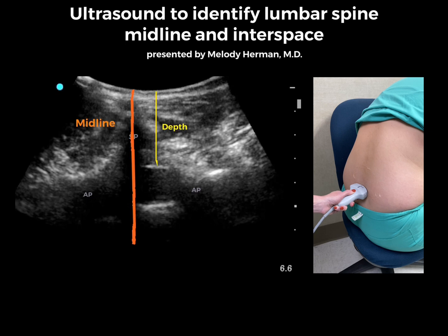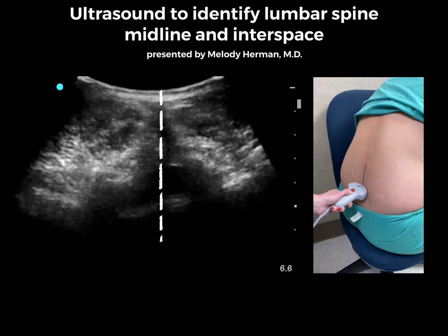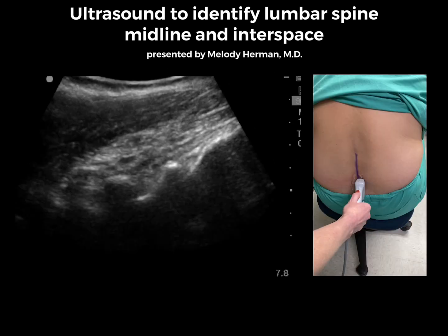Keep in mind that the actual depth where we have loss of resistance or CSF return is likely to be a little deeper, because we're pushing down on the subcutaneous tissue with the ultrasound probe. Draw a vertical line with a marking pen to identify the midline.